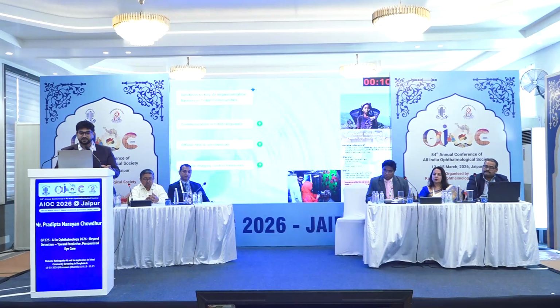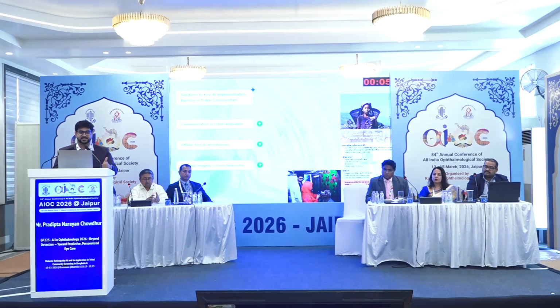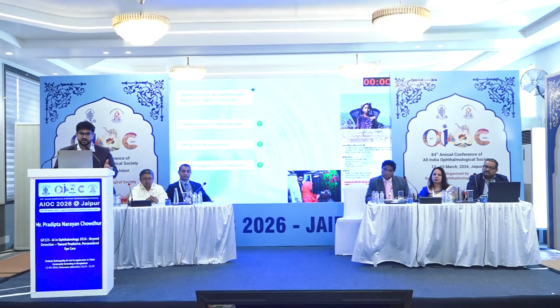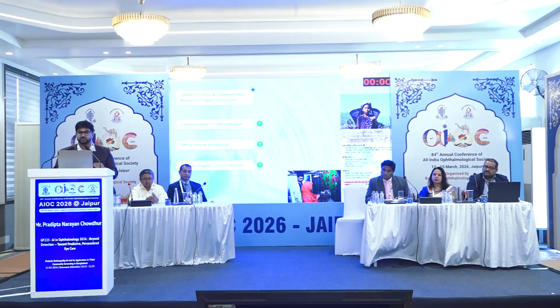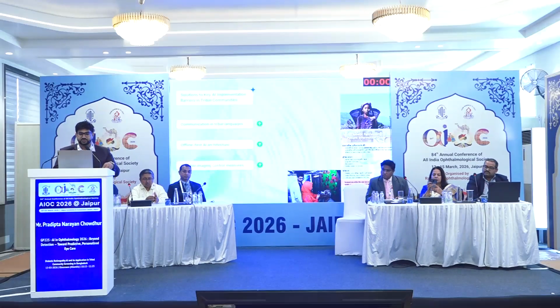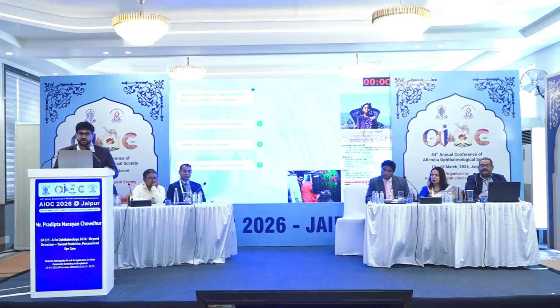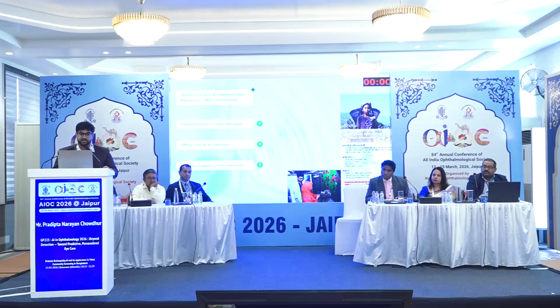But we did find some solutions. The first thing that we're very proud of is, if we're going to the indigenous areas, we need them in the play. So we had focus groups with the tribal communities, and we tried to build everything around their tribal language, like the pamphlets or any health information. We tried to incorporate their input into our AI. And secondly, we would have the offline-first AI architecture because there is lack of cellular coverage. And finally, the portable imaging countermeasures.